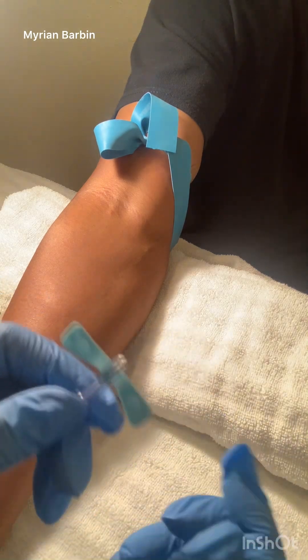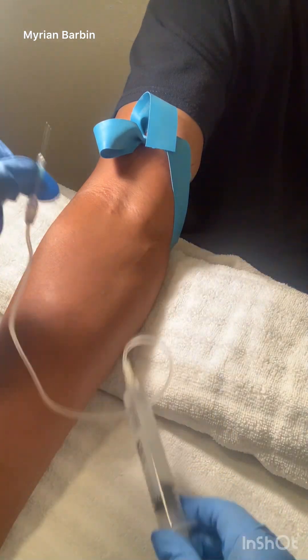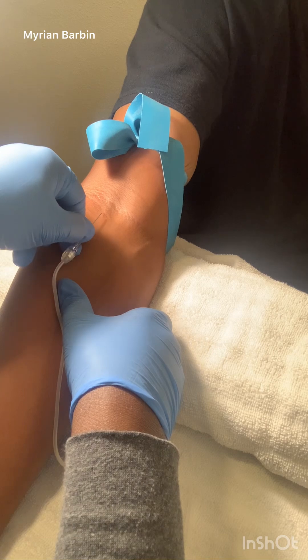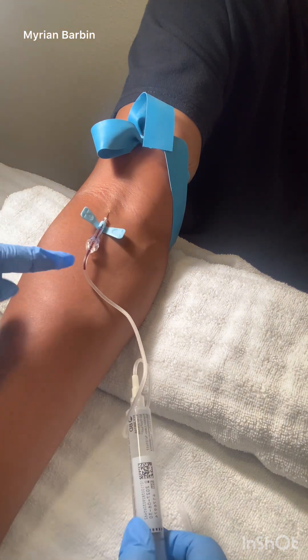Make sure the bevel of the needle is up. You can squeeze your wings. Tell the patient you'll start on the count of three. Once you are starting, release your wings to see the blood flowing.